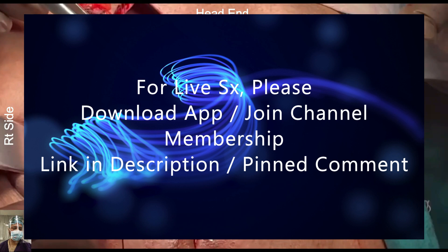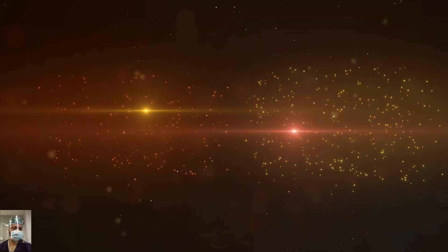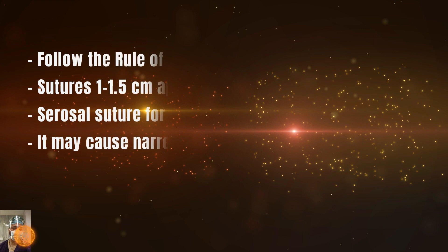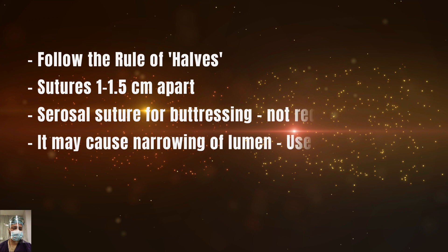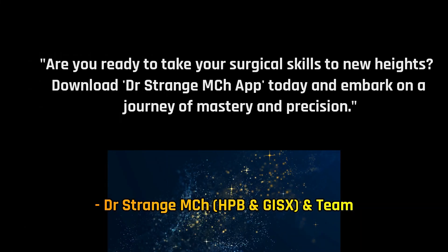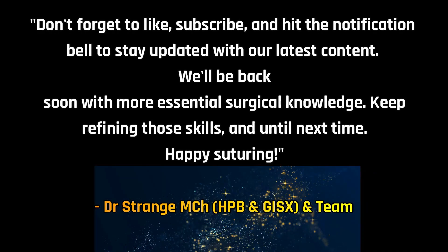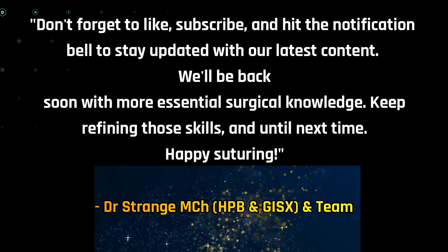After giving the incision and taking the stay stitch, we lay open the strictured pylorus. Here we have taken the first bite, coming out from serosa to mucosa. Keep around one centimeter apart and do not apply another layer of serosa suture to buttress the Gambee stitch, as that will lead to excessive inversion and may cause narrowing. If you have any concern, you may apply one or two stitches over the Gambee stitch, but not as a rule covering the whole layer — use your discretion wisely. Keep practicing, and every stitch you make brings you one step closer to mastery. Embrace the challenge, embrace the journey, and become the skilled surgeon you aspire to be. Thank you very much for watching — stay connected, happy learning!